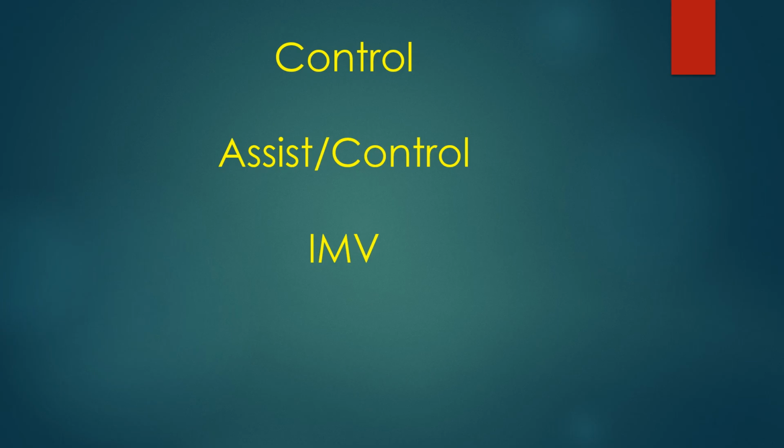And then every now and then somebody would invent something new for the ventilator to do, and engineers would design the technology to achieve those things. But then along came microprocessors. And when microprocessors started to control the ventilators, the engineers could make that ventilator do anything. Anything that a respiratory therapist or a doctor would dream up or think would be a good way to ventilate a patient, because of the microprocessor, the engineers could make the machine do that, whatever it was. And so that's where the confusion started.